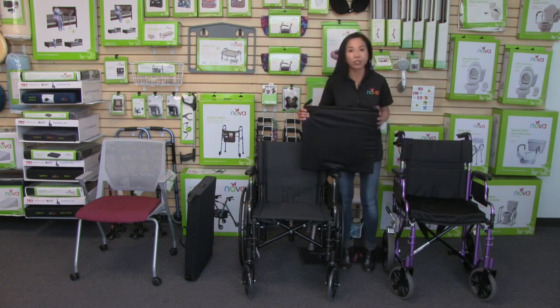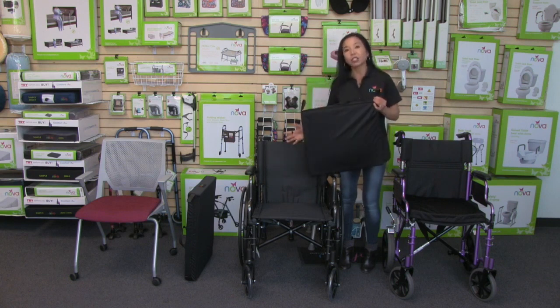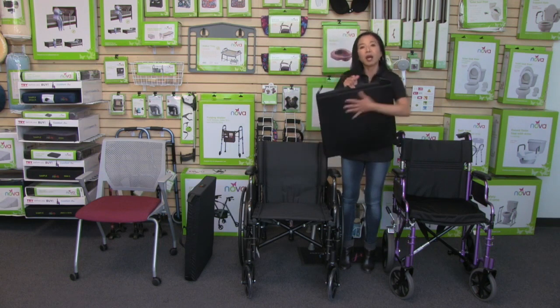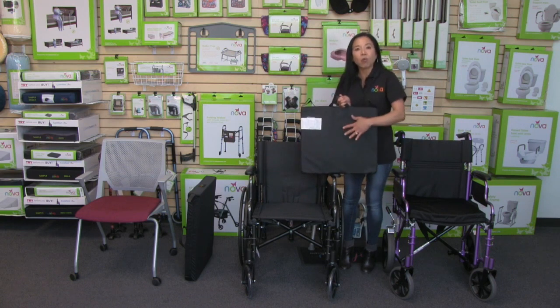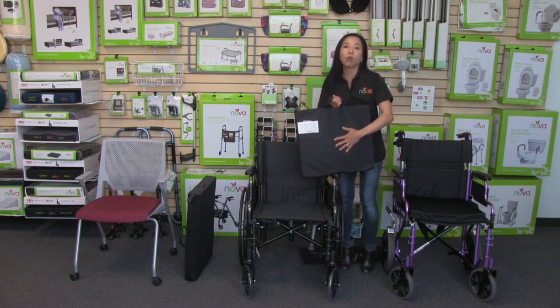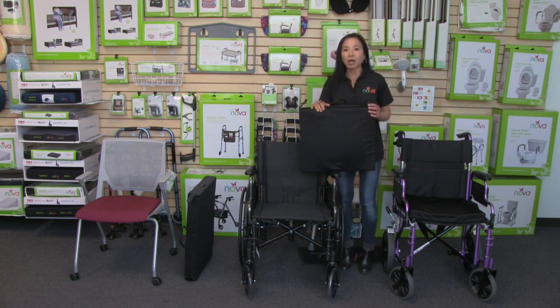This wheelchair cushion is not just for wheelchairs but also transport chairs and regular chairs — it gives you so much support. It comes with Velcro straps so you can attach it to a chair or wheelchair, it has a convenient handle, the cover is zipper removable and washable, it's water resistant, and the bottom is skid resistant to keep it from shifting. The bottom is also waterproof.